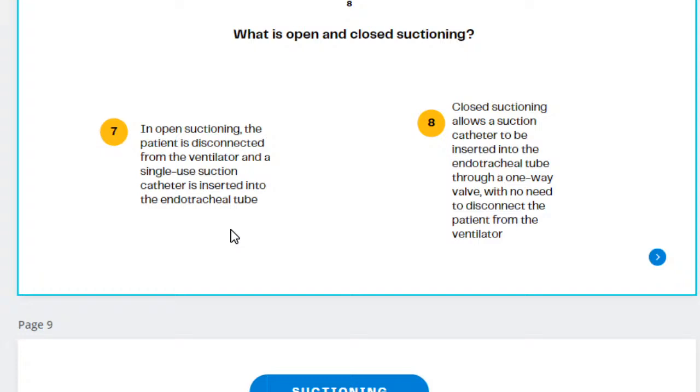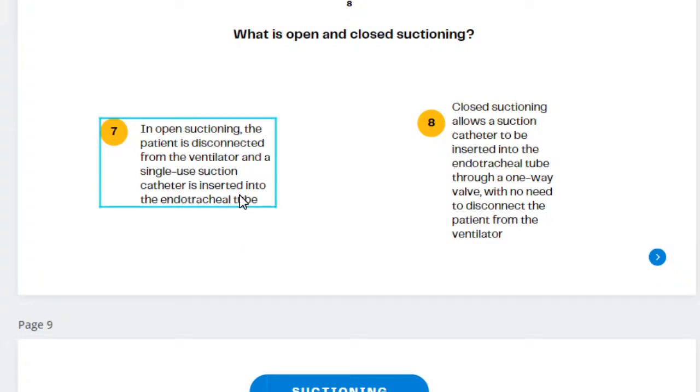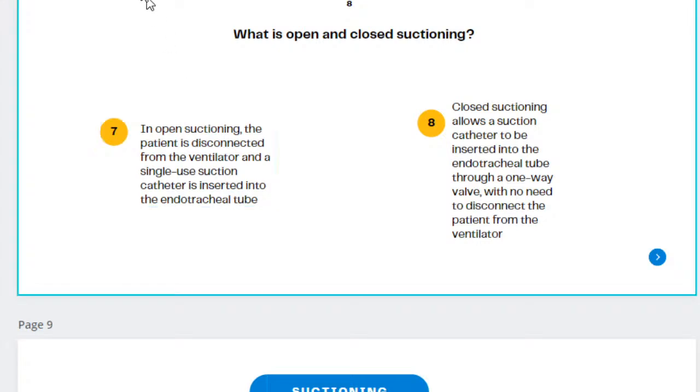It's not that long. Let me see what size I would say. I don't have a way to measure it for you now. The open one is the one that you fold in your hand, and then you put your finger on the suction hole, pressing intermittently each time you close the little hole. Each time you apply pressure, that's when you close the opening. And when you release your finger from the opening, there's no more pressure.